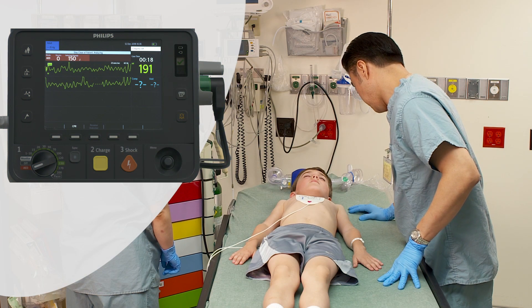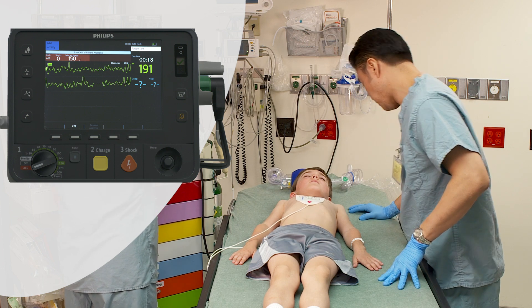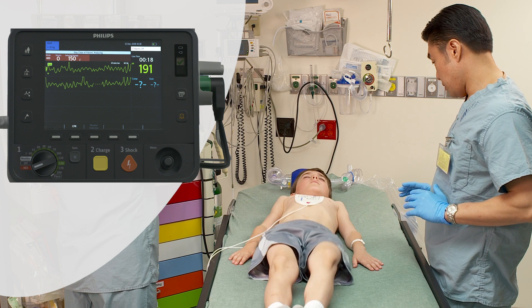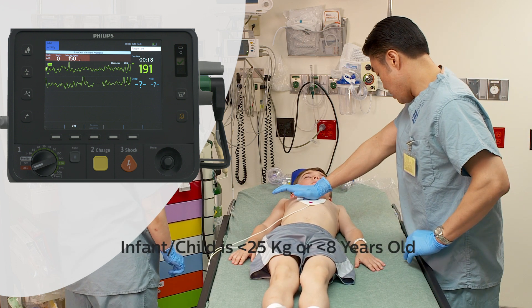When operating in AED mode, the HeartStart Intrepid can perform semi-automatic external defibrillation on both adults and infant-child patients. You can also monitor the patient's cardiac rhythm, SpO2, ETCO2, and airway respiration rate in AED mode.